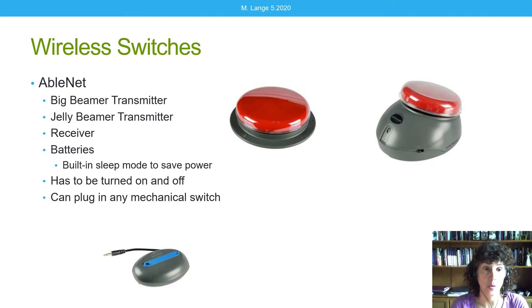AbleNet has wireless switches in their Beamer series — the Big Beamer pictured here in the middle and the Jelly Beamer off to the side. These are the size of their Big Red and Jelly Bean switches and are designed for someone to hit with a hand. There is a switch jack on the side so you can plug in any switch and place it where the client has better control. A receiver is required, pictured on the bottom left. Both the transmitter and receiver have to be turned on and off. These have batteries inside, and unless you buy rechargeable batteries you will have to replace them periodically. They do have a sleep mode that helps extend battery life.